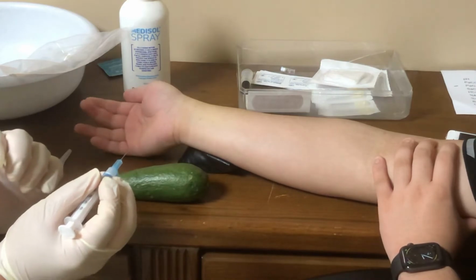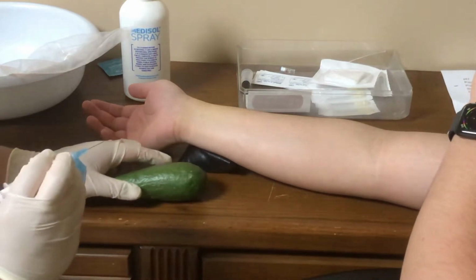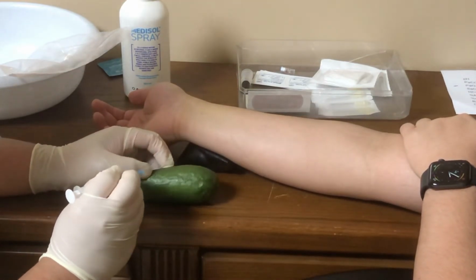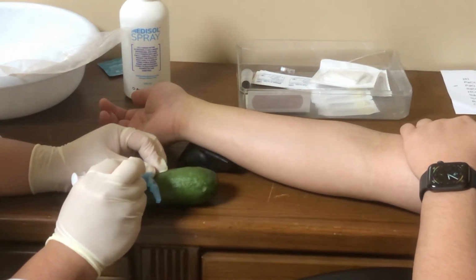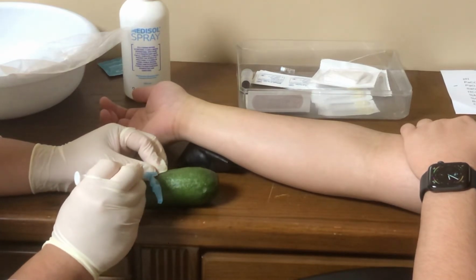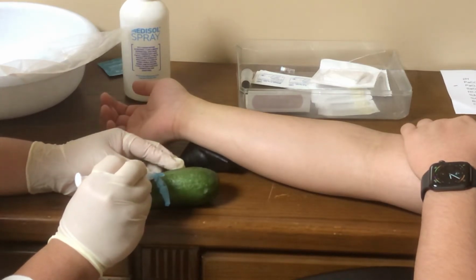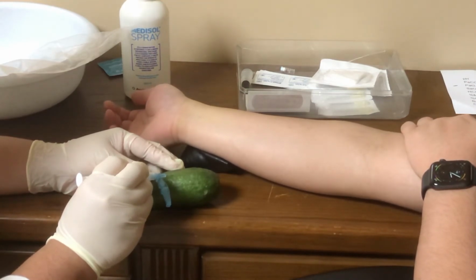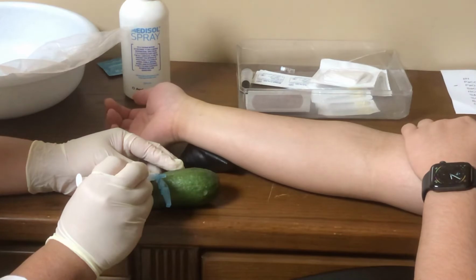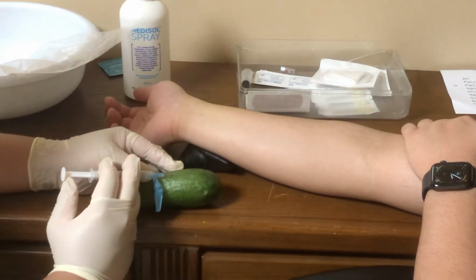It is also important to note that the certainty of position is more important than the angle. So now, with the radial artery here, bevel up, we're going to be slowly puncturing the radial artery. Make sure to observe the syringe for any flashback of arterial blood. If there's any flashback, it means you have successfully entered the radial artery. For a plastic syringe, you need a gentle aspiration of the syringe. And for a glass syringe, flashback occurs readily.